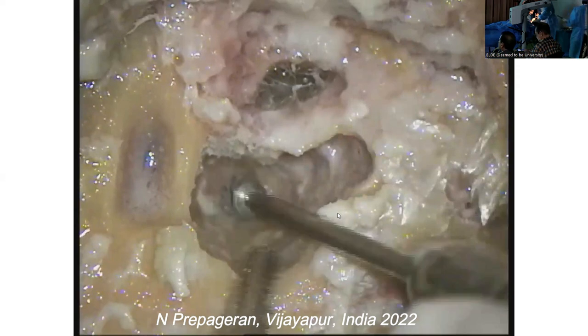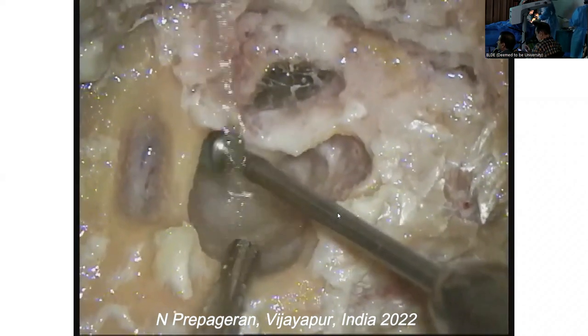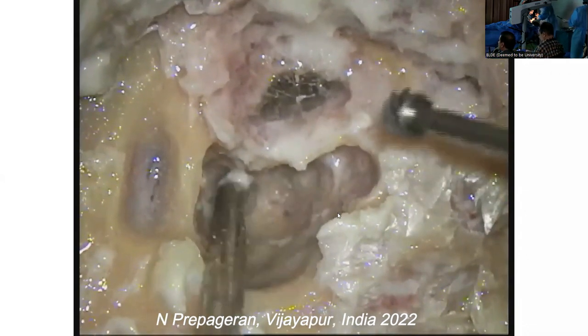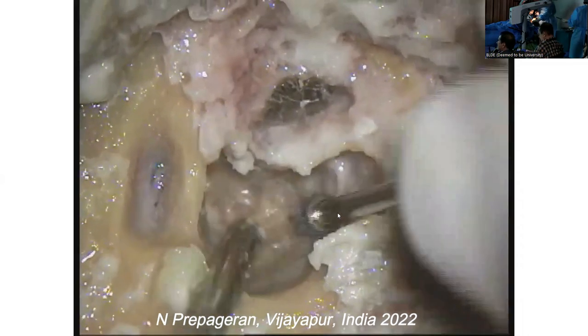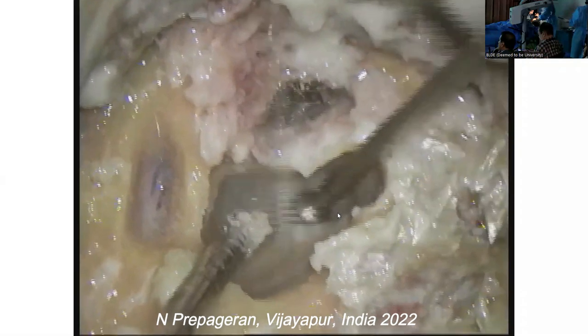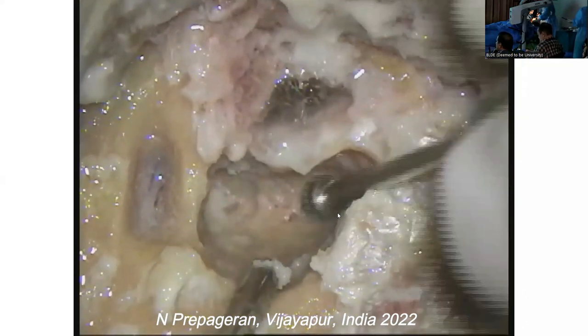with that. That's the lateral semicircular canal coming into view, guys. Can you see? So what I want to do now is go underneath to the mastoid tip. That's the mastoid tip coming into view.